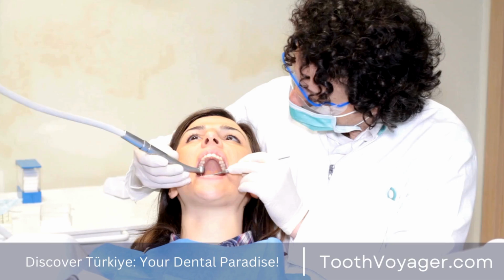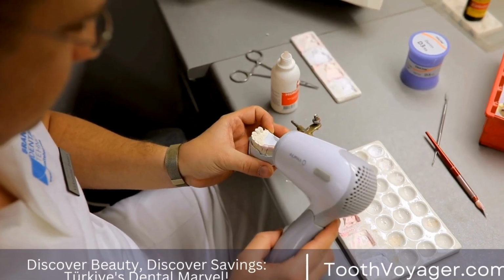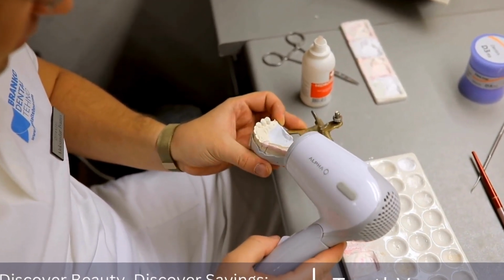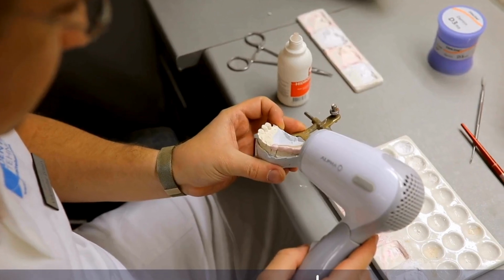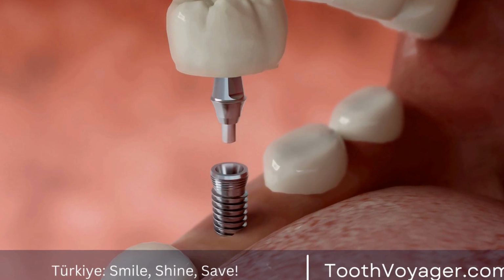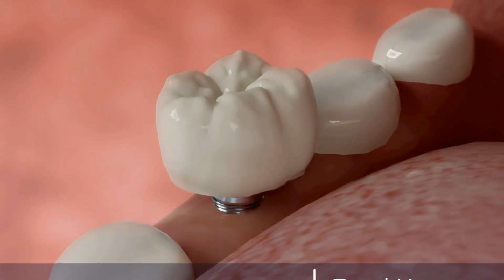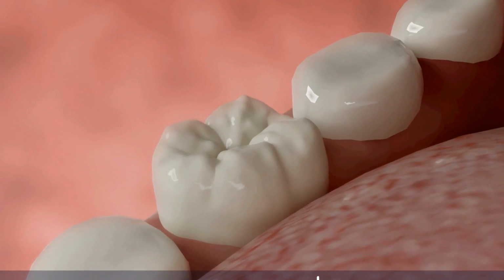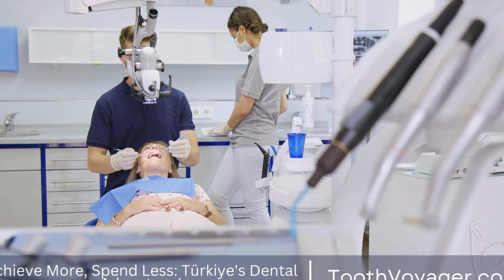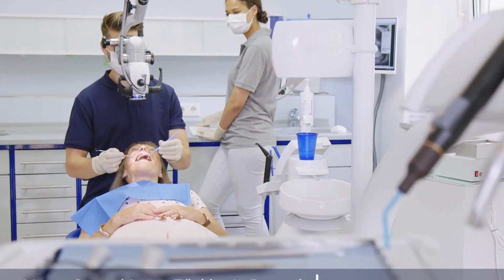5. Mini dental implants. Mini implants for dental use are less invasive and less bulky than conventional implants, which makes them an ideal choice for those with little space or bone density within their jaw. Mini implants are usually utilized to support dentures or bridges and are able to be fitted using less surgical procedures than conventional implants. Mini dental implants can be an excellent option for those looking to reap the benefits of implants, however do not have the bone mass to support the larger implants.